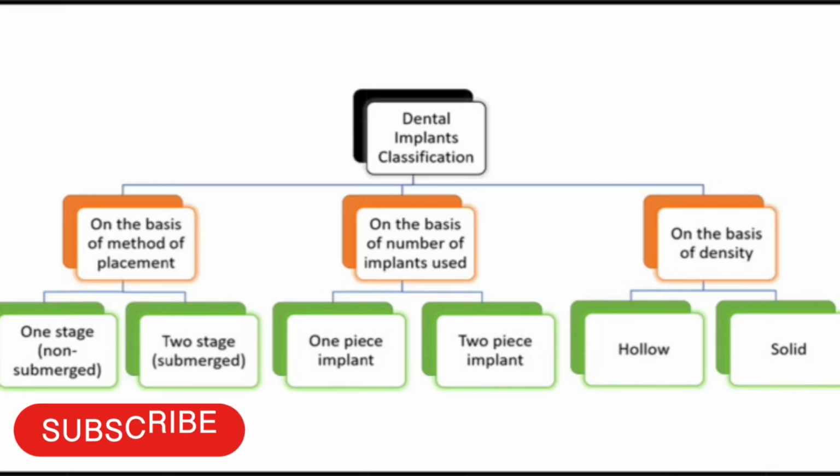Now we have a classification where we have classified dental implants on the basis of method of placement, on the basis of number of implants used, and on the basis of density. On the basis of method of placement, we have one stage and two stage implants. On the basis of number of implants used, we have one piece or two piece implants. And on the basis of density, we have hollow or solid dental implants.